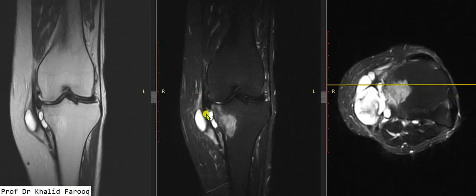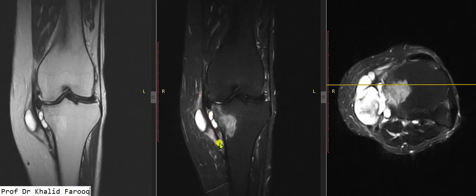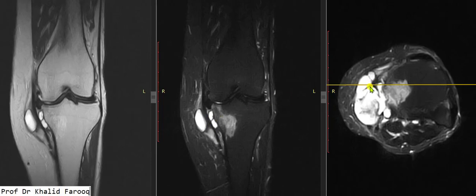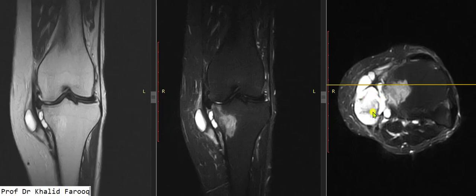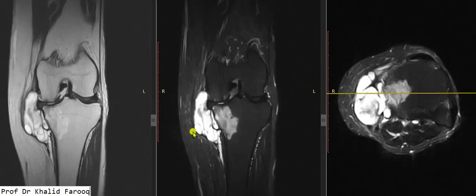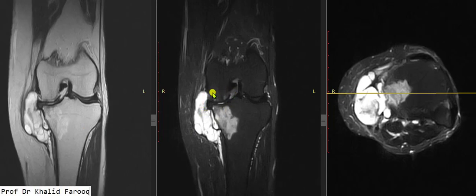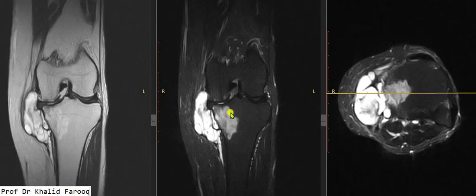Here we can see fibers of the medial collateral ligament, which can be confirmed on axial images where few fibers are separated by the ganglion cyst. We can see degenerative changes noted in the medial joint compartment where marrow edema is appreciated.